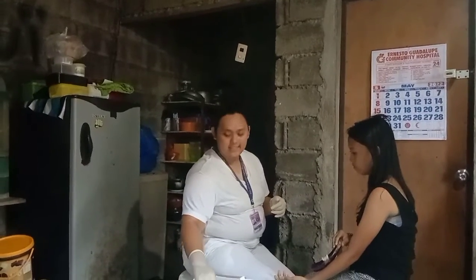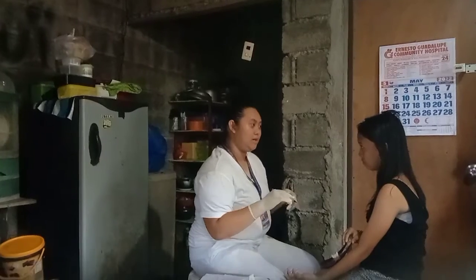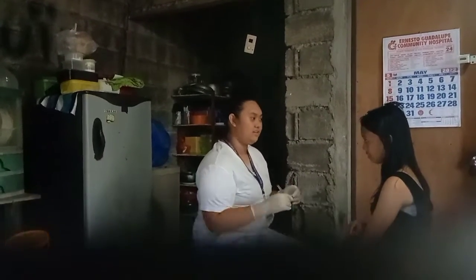Encircle the wheal with a blue or black ball pen and instruct the patient to not rub the wheal or erase the mark, so that the patient will know that in that area is not allowed to rub or erase. Okay, I am going to put a circle mark here on your arm and do not erase it, okay?